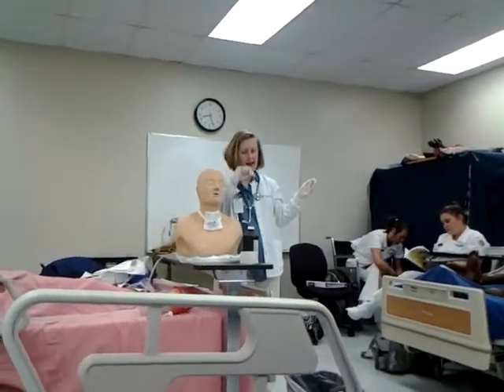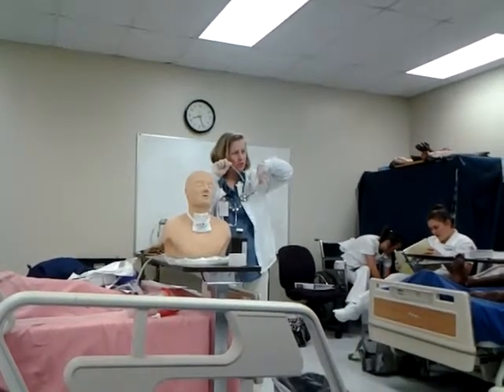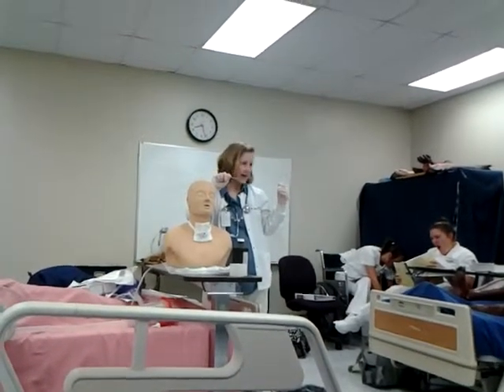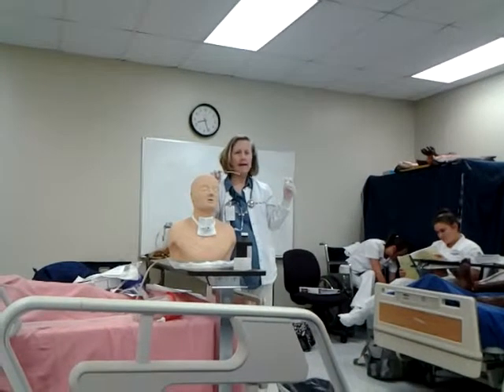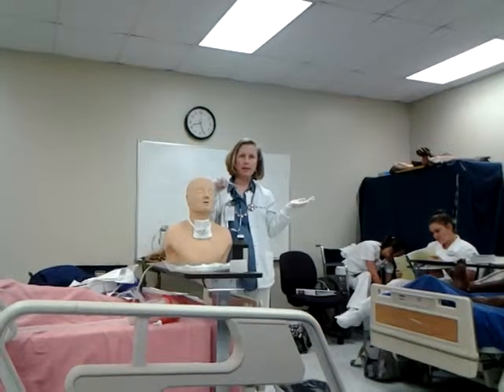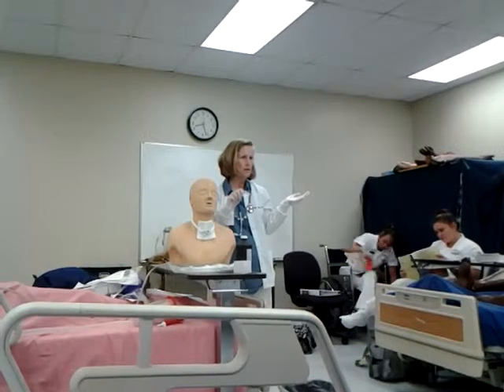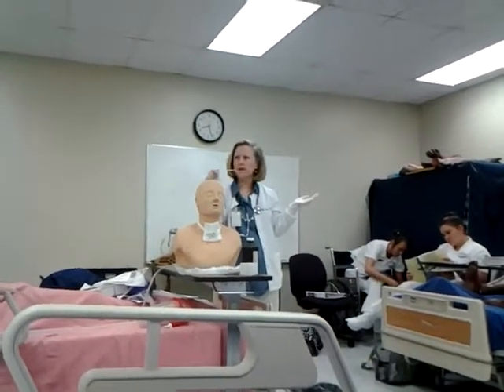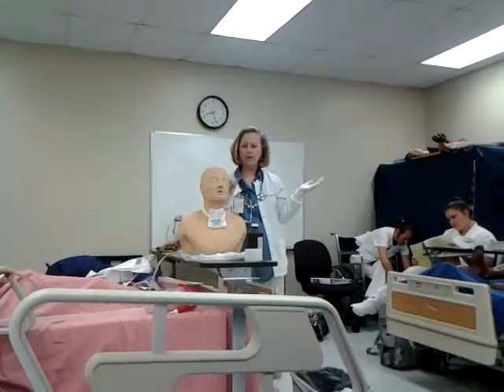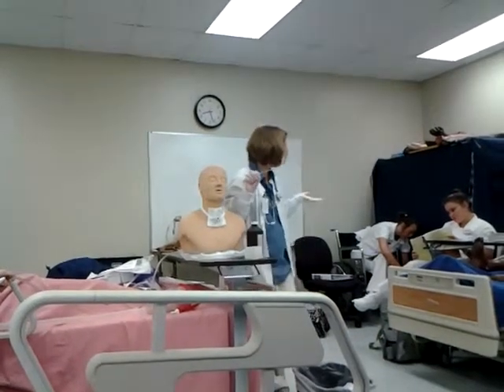Right. If you happen to hit the carina, which is where the bifurcation of the bronchi are, the patient, do you think that would hurt? Yes. And they'll cough too, right? Coughing is not a bad thing, but if you hit that, come back a little bit. You don't want to go till you hit the carina. Do you think over and over that could cause trauma? Probably. Yes. So you don't want to go that far. And they say three passes, 10 to 15 seconds.